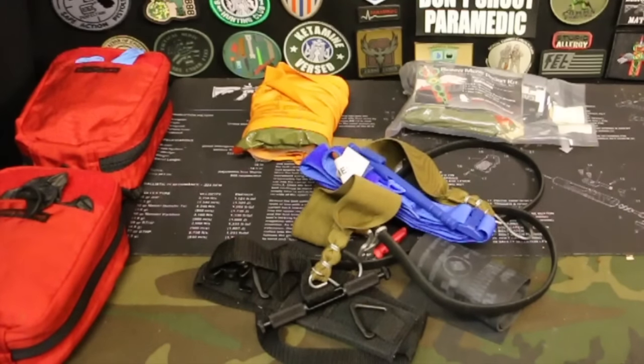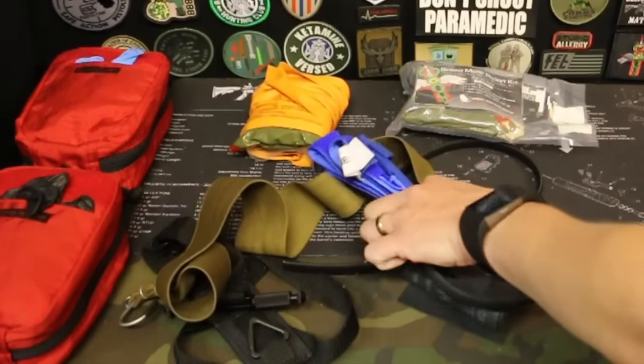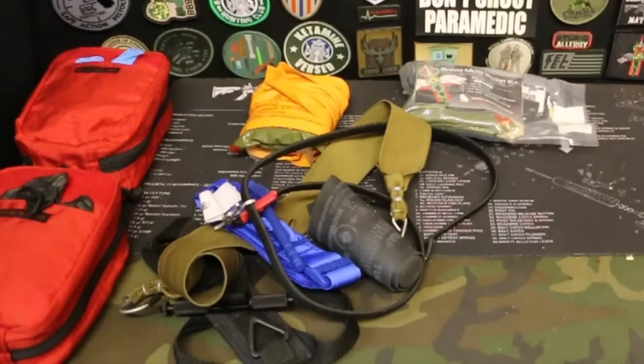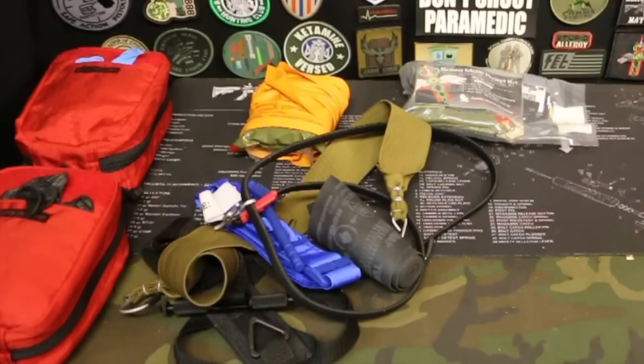The first component I want to look at with a hemorrhage control kit is a tourniquet. There are plenty of tourniquets on the market and everyone has an opinion on which one is the best. So pick one — it doesn't have to be a SOF-T, a TK-4, the CAT, RATS, SWAT-T — whichever one you want to choose. Pick it, and then get some training with it. Know how to use it, know how to apply it to your arm, know how to apply it to your leg.